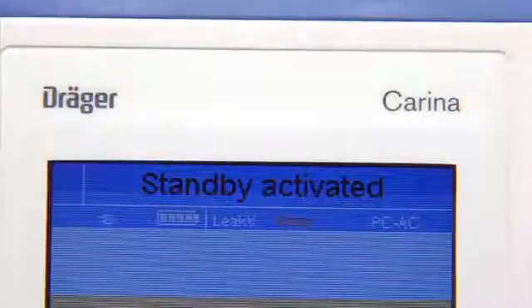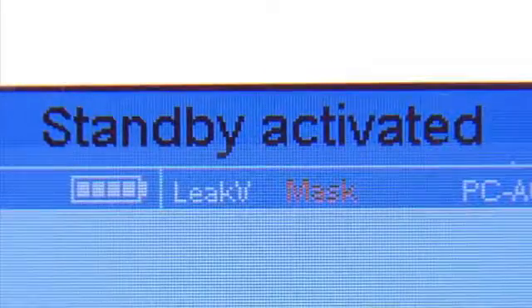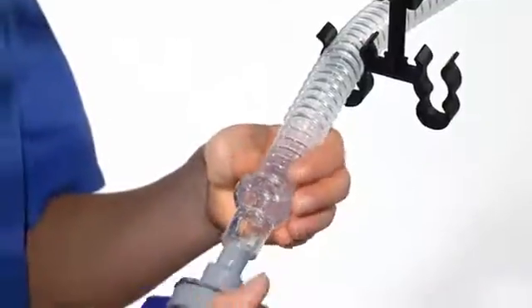Please check the patient connection mode in the status line. It can be set to mask or tube. If it doesn't correspond to the used type, please make the necessary changes. Connect the test lung to the patient circuit.